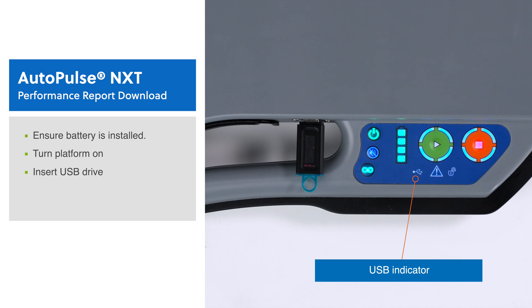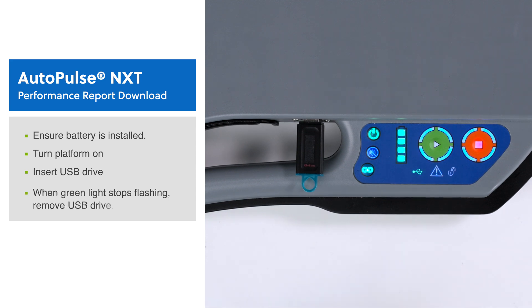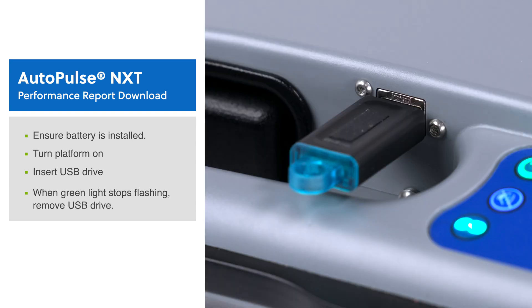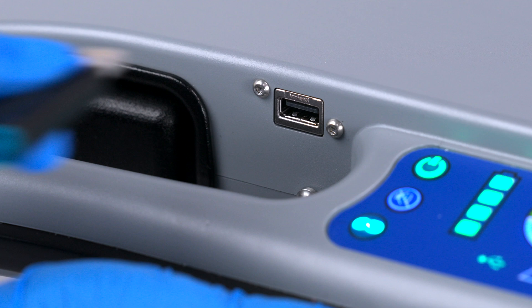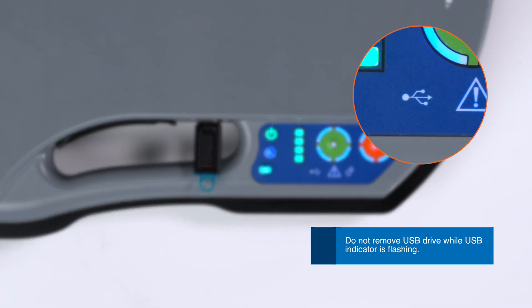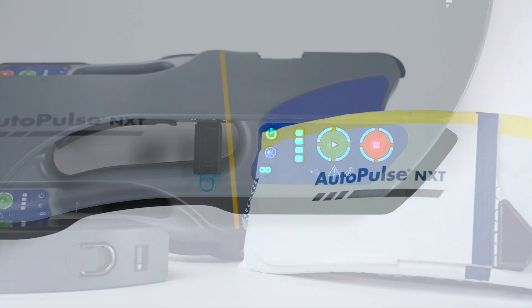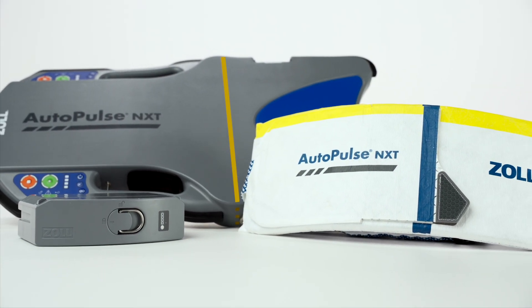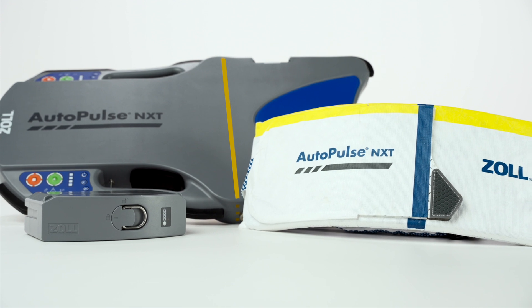When data transfer from the platform to a USB drive is complete, the indicator illuminates continuously. Wait until the USB indicator stops flashing and remains illuminated. Remove the drive. To avoid damaging the USB drive, do not remove it while the USB indicator is flashing. We have now reviewed how to transfer data from the AutoPulse NXT Resuscitation System using the USB port.